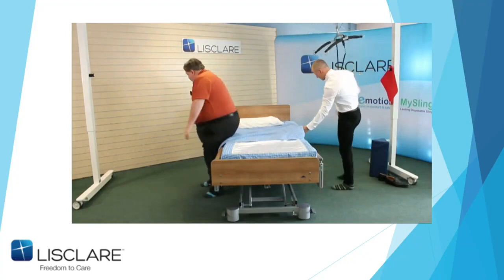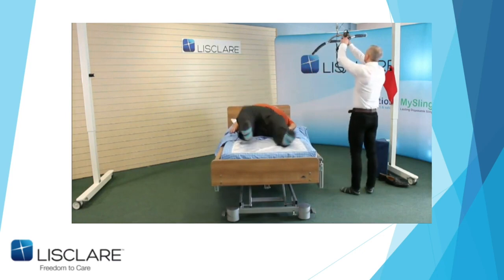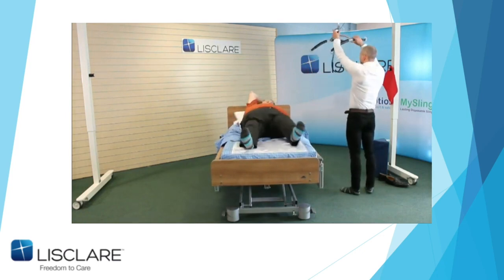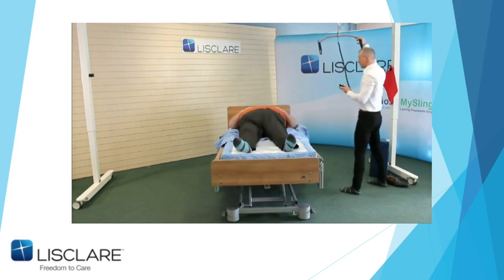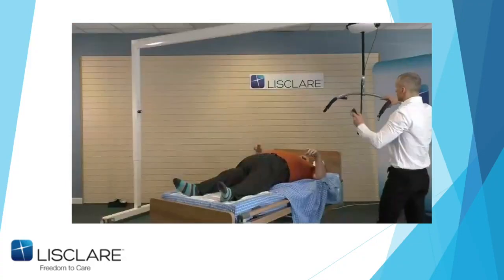Now, you may hear me talking, obviously, to John. I get the light out. Now, obviously, this isn't the 120 wide bed. And normally a patient of my size would be on a 120, but this saved me chopping it around, and it actually makes it more challenging for John.